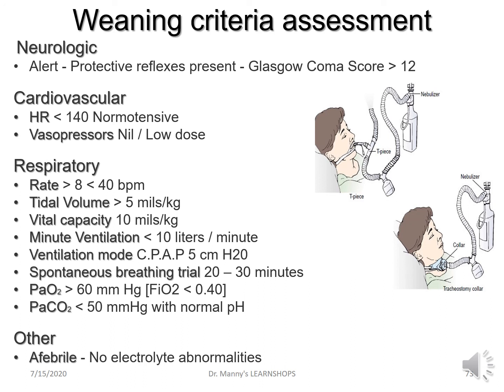They should have a spontaneous breathing trial depending on the unit, which again lasts for about 20 to 30 minutes with appropriate levels of blood gases determined by the unit. So PaO2 should be at a good level and PaCO2 should be at a good level. They should be afebrile with no electrolyte or acid-base derangements.